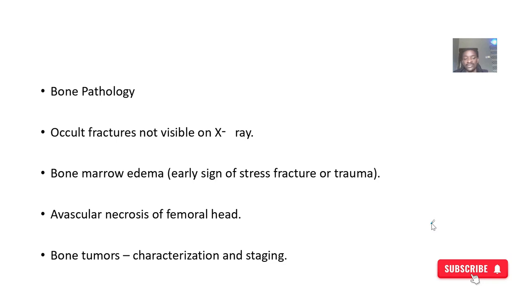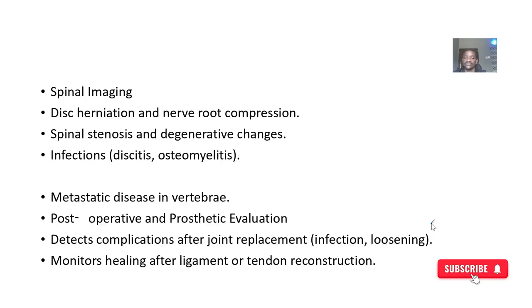Also bone pathology can be diagnosed, including fractures. Bone marrow edema, so there's accumulation of what? Fluid in the bone marrow. This can actually be picked up. Avascular necrosis, so it can be used to identify when the blood supply is cut off. Also used in diagnosing tumors, confirming tumors.